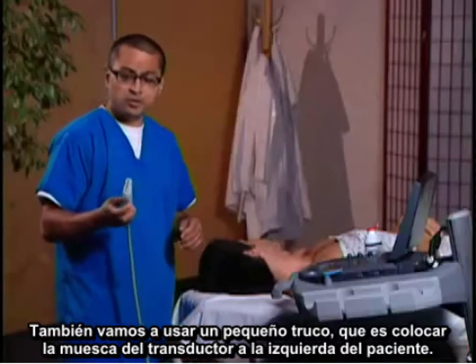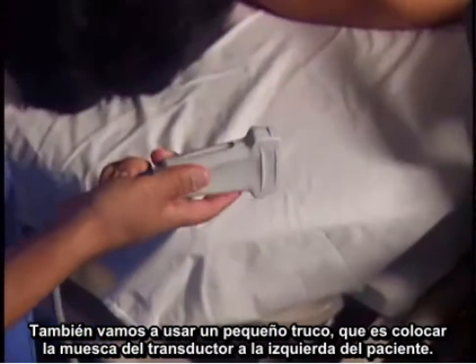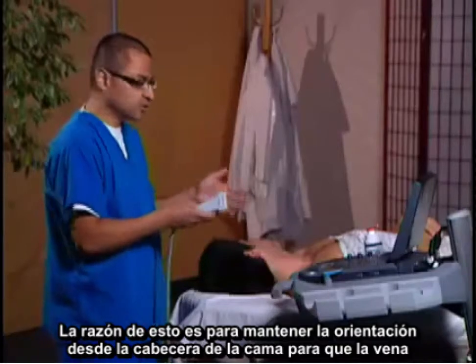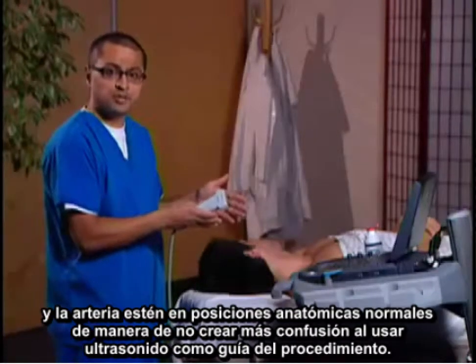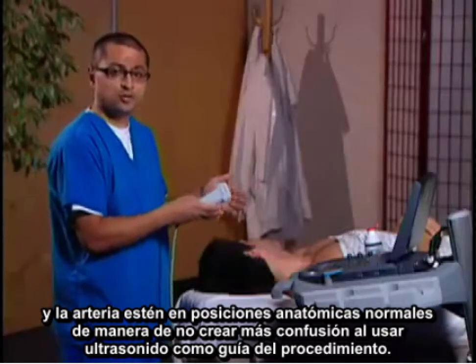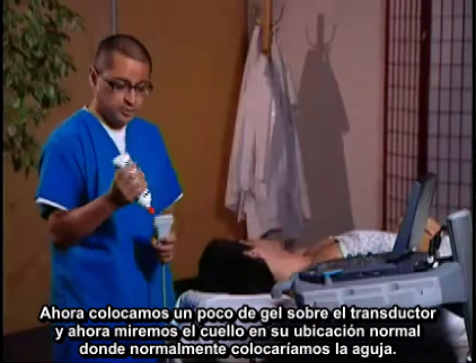We're going to also use a little trick to put the transducer marker actually to the patient's left. The reason I do this is to maintain the orientation from the head of the bed, so the vein and the artery are in the normal anatomic positions, so it's not to create more confusion when you're using ultrasound for guidance of a procedure. I'm going to go ahead and put a little bit of gel on this transducer.